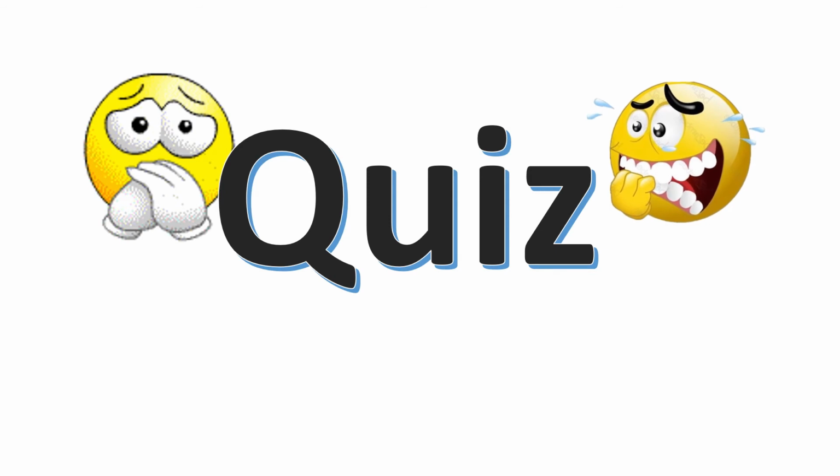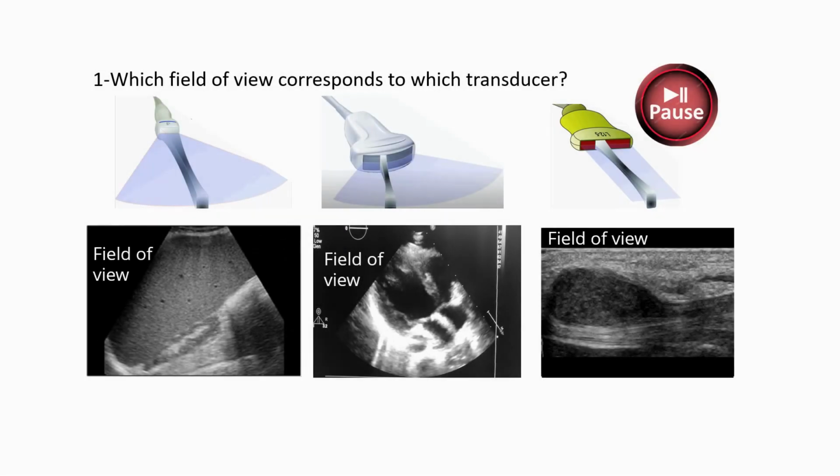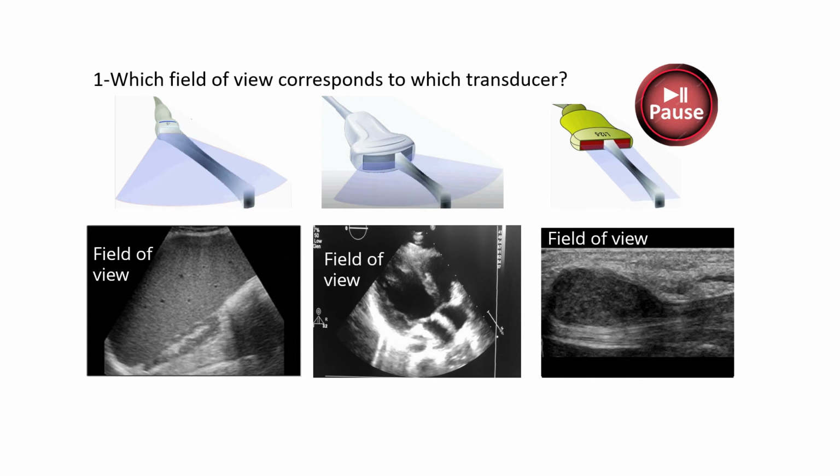Well, it's that time. Time for the quiz. Here the answers will follow the question or problem, but hit pause and try answering it first. Problem number 1. Which field of view corresponds to which transducer? Hit pause and try your own choices.